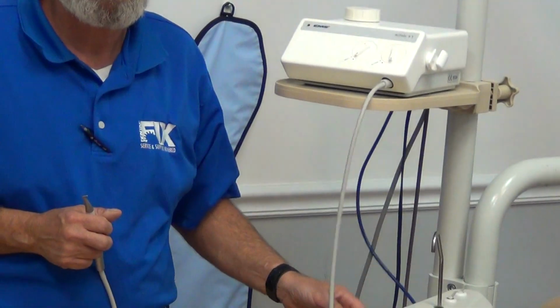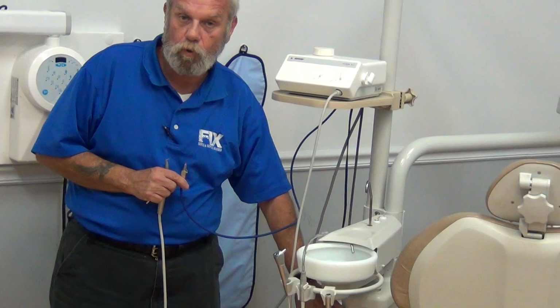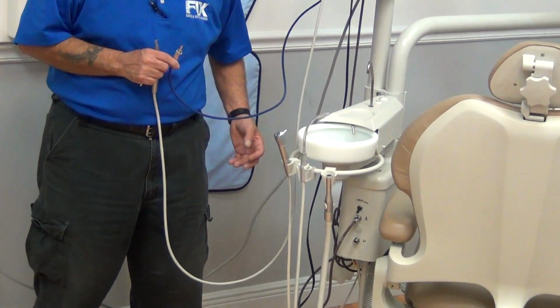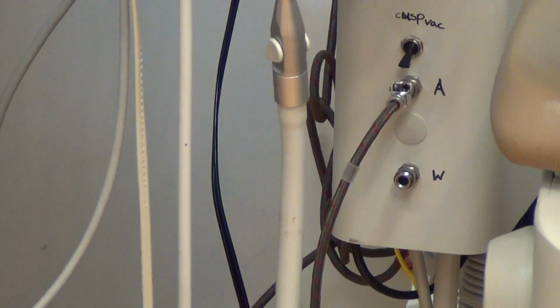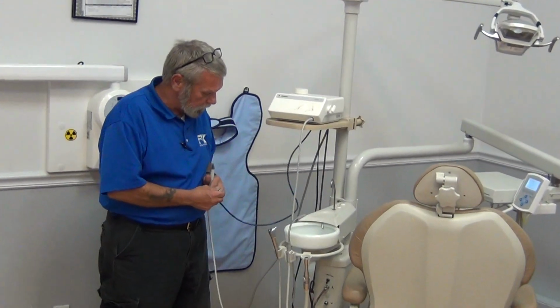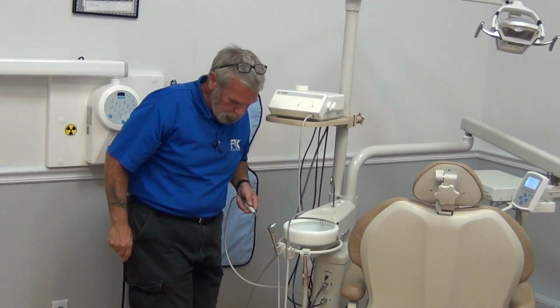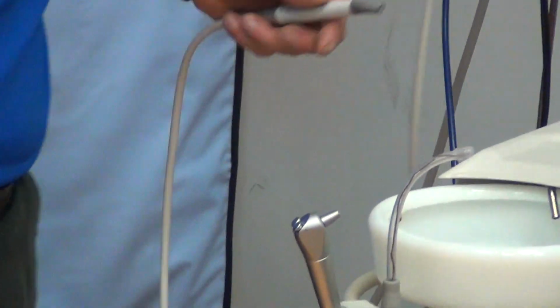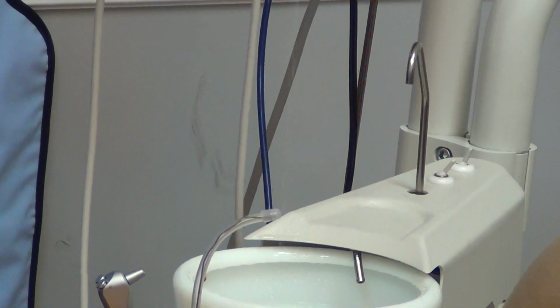What's the next step? Check where the water connects into the delivery system. Usually they're going to plug in under the cuspidor if there's a cuspidor present, if not in the assistance console, by a quick connect delineated by A or W, air or water respectively. Sometimes they will be hooked into the junction box as well. You have to climb down under the junction box and make sure your connection's good. This one, our male quick disconnect, was not plugged into our water outlet. So we're going to plug it in and make sure our delivery system has water by checking the syringe. We've got water to there, which means we're going to have water to the quick disconnect. Now we're going to gently press on the foot control. And voila, we have water.